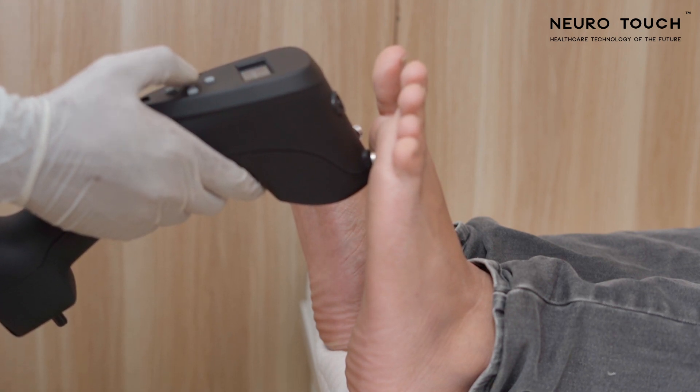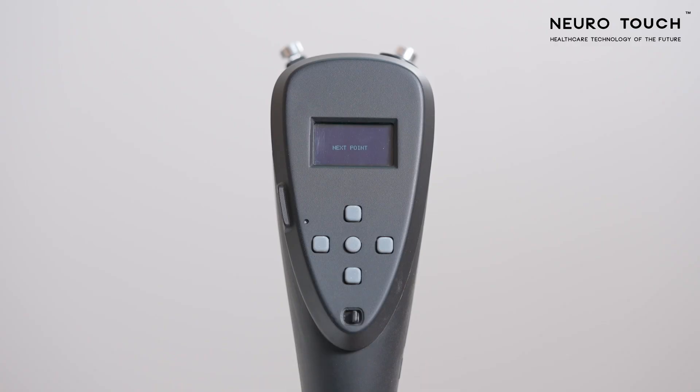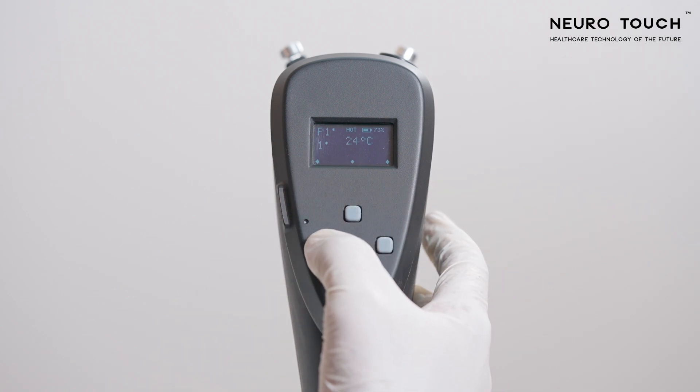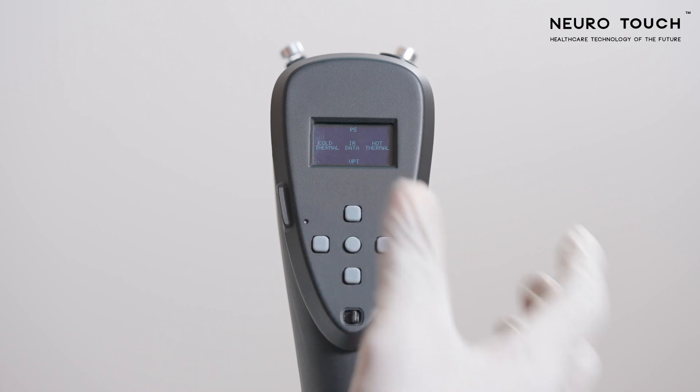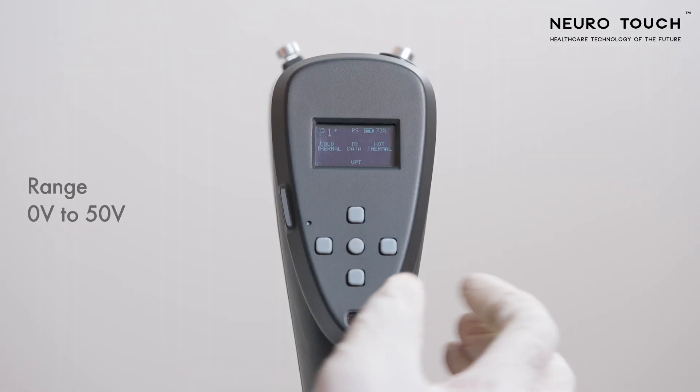After screening all 12 test points, the display will come back to test point one with a star next to it. The star indicates that the data has been saved at that particular test point. Check all points to ensure none have been missed. You can redo the test on any particular point. Come back to the home screen by long pressing the left key.